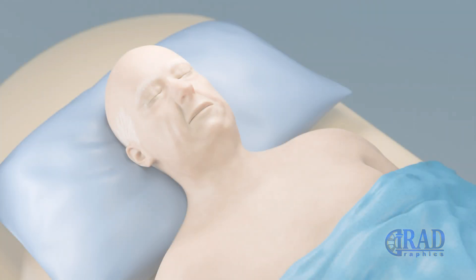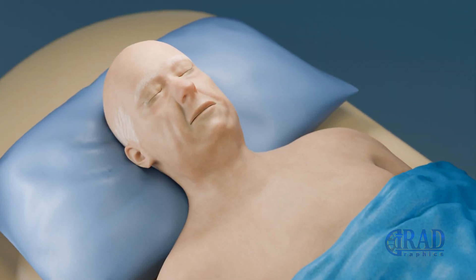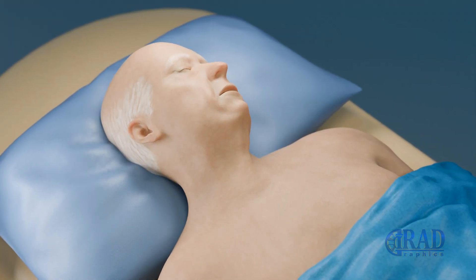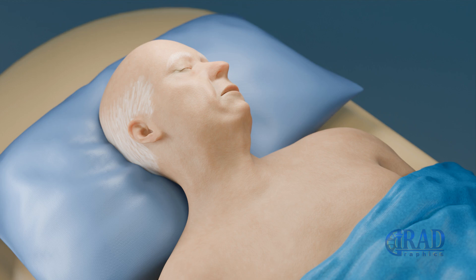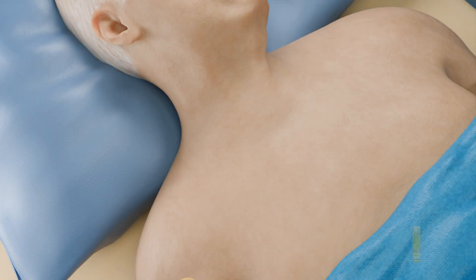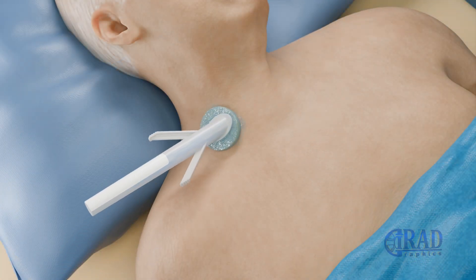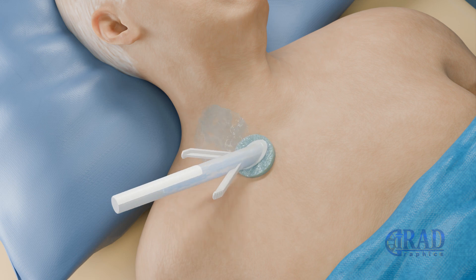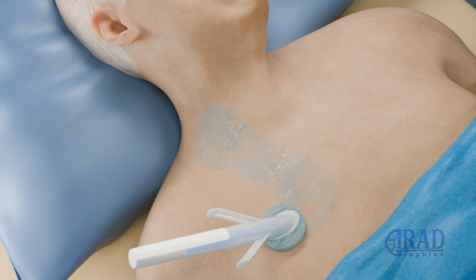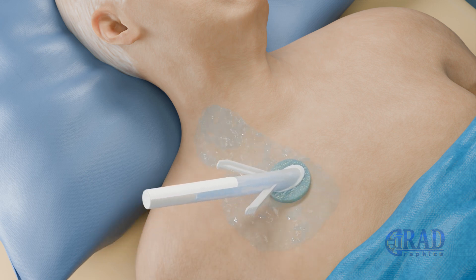The patient is positioned supine on the procedural table with the head turned away from the access site. The skin is cleaned, sterilized, and draped in a sterile field to minimize infection risk.